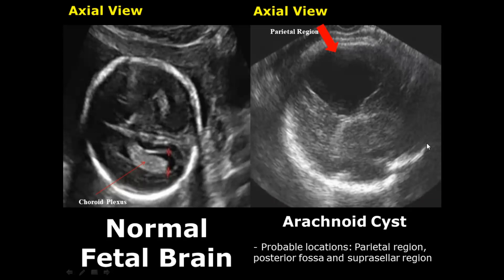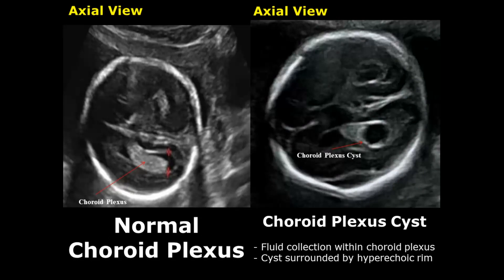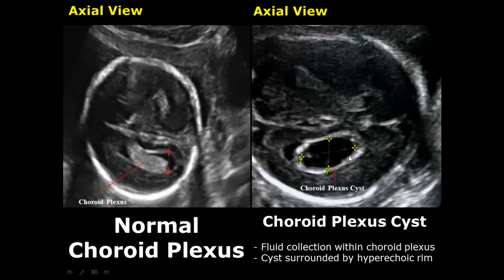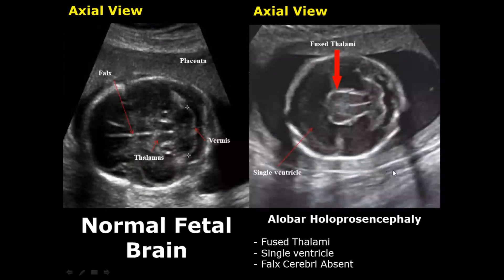A choroid plexus cyst is present inside the choroid plexus. Since the choroid plexus are hyperechoic structures, a cyst inside will have well-defined echogenic walls. Here is another image of a choroid plexus cyst showing its hyperechoic walls.